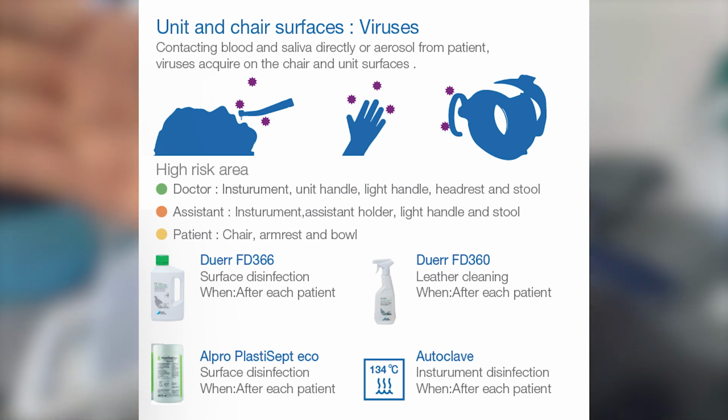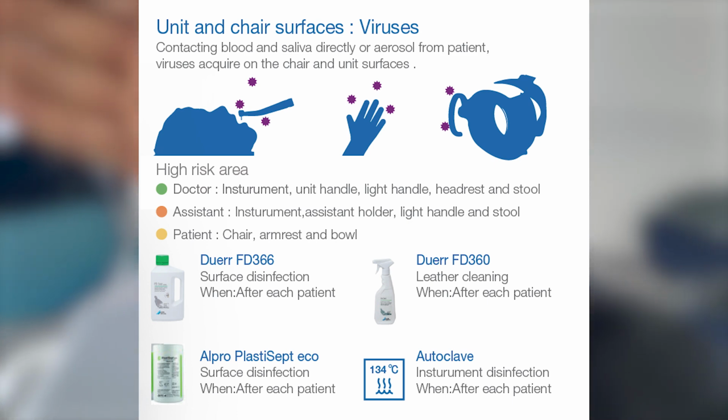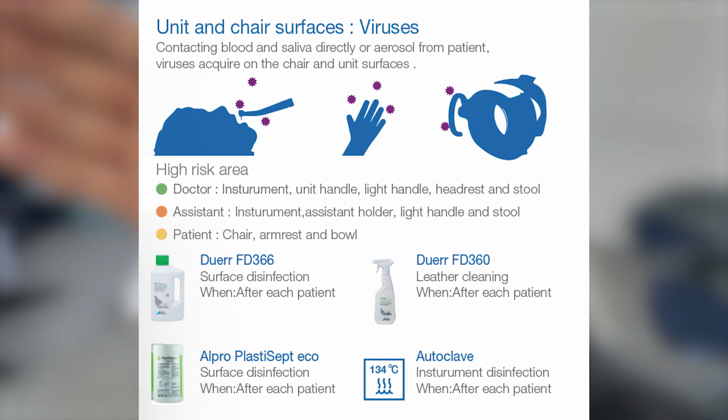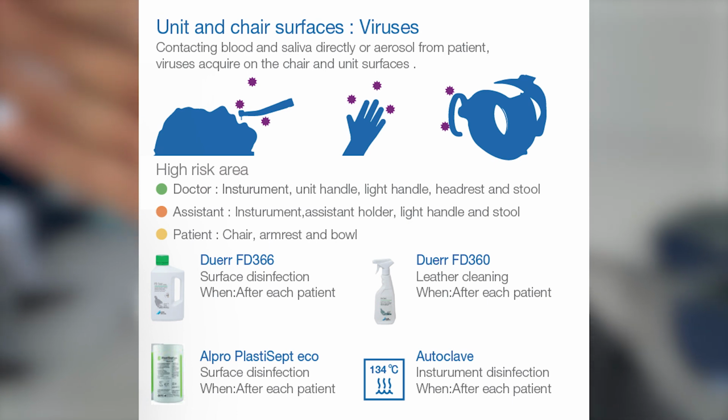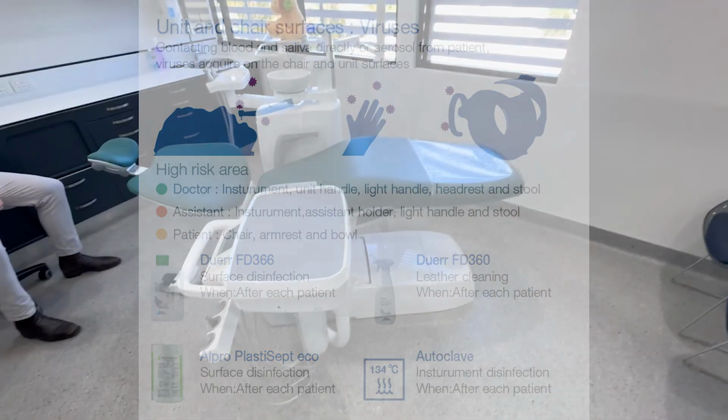We're not going to go deep into what needs to be done in each case. Have a chat with us at Leading Dental to make sure you're using the right product and using it effectively, and also follow the instructions outlined in this document. So just keep that in mind. That's very important to keep your chair in tip-top condition and also keep all of your warranties valid.